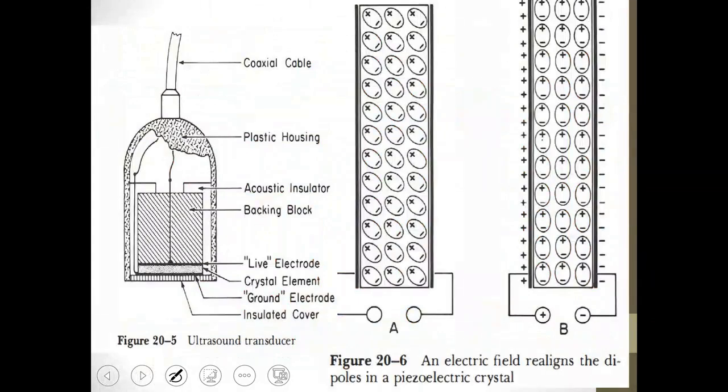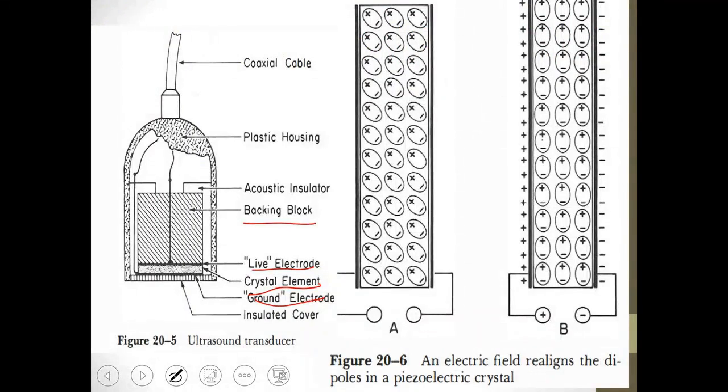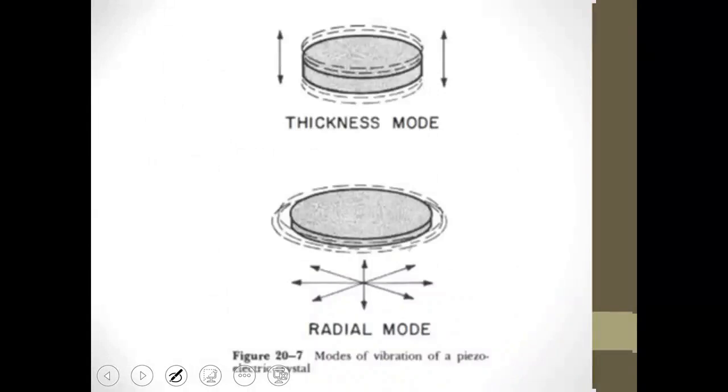This is the shape of the crystal from the inside, and these are the crystals present. And this is the process of applying the electric field and turning it on and off, which is controlled by the thickness of the crystal present. Now let's go back to that part.